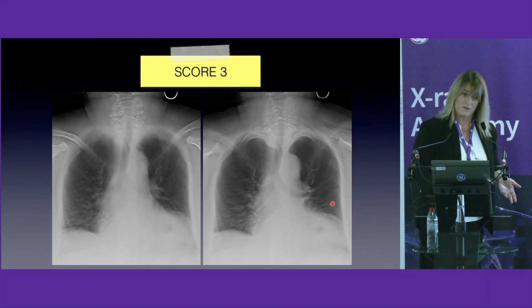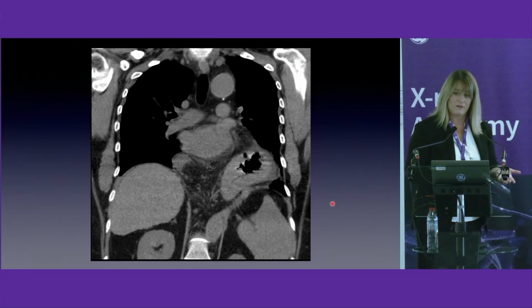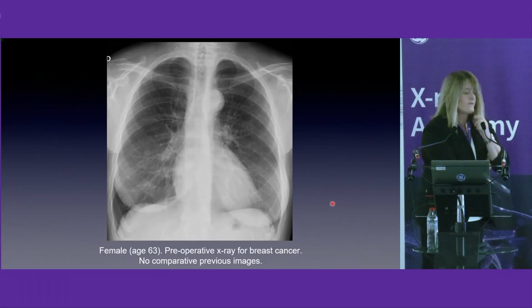So, we performed a CT scan and it was a gastric hernia. So, sometimes we have to perform a CT scan to clarify our doubt. We weren't able to do that because of the clinical status of the patient. No, because this one was acquired in the supine position.